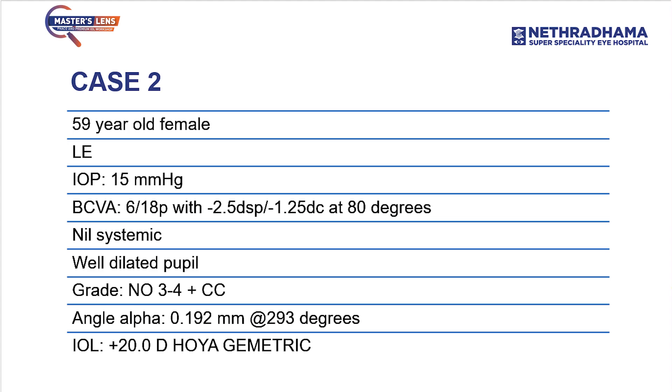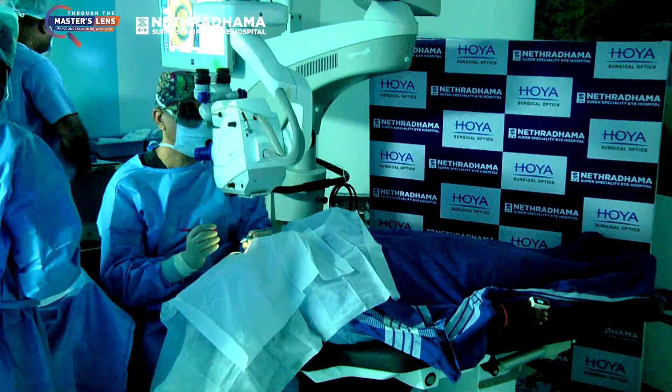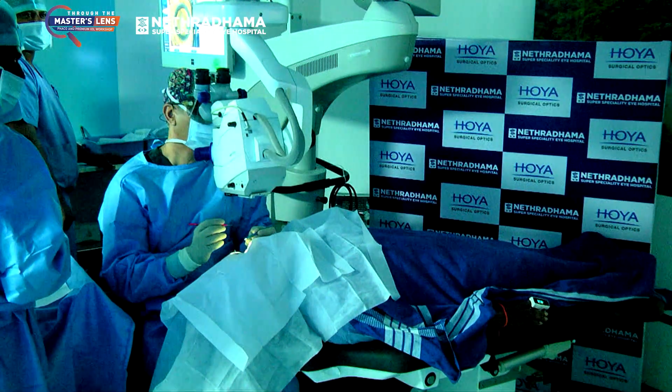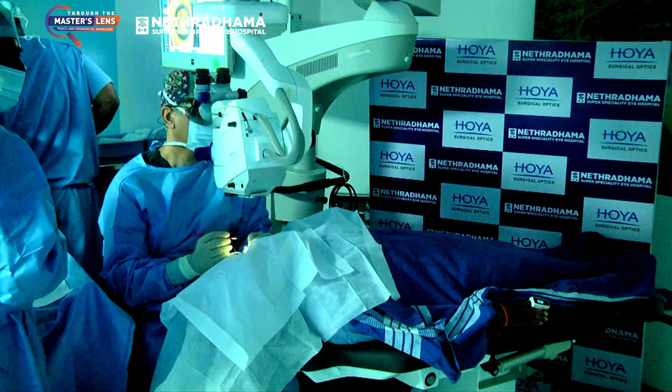We are starting with a 59-year-old patient with a grade 3+ cataract. The femto-rhexis is already done. I like to do the femto-rhexis because you get a perfect capsulorrhexis and a nice 360-degree overlap. It's a 5 mm rhexis, and we are going to use a 20-diopter Hoya Geometric Plus. This is the left eye of the patient, so we are using a Geometric Plus.